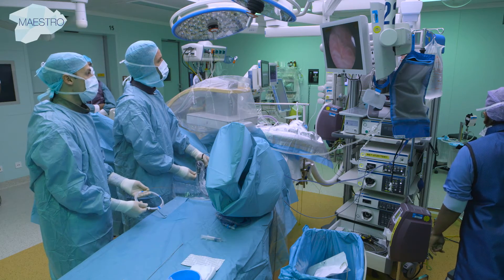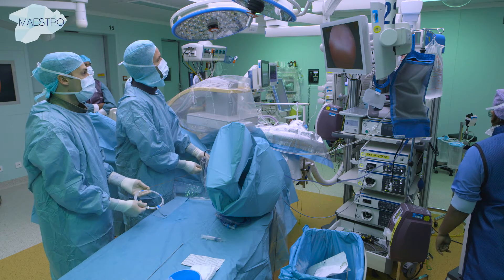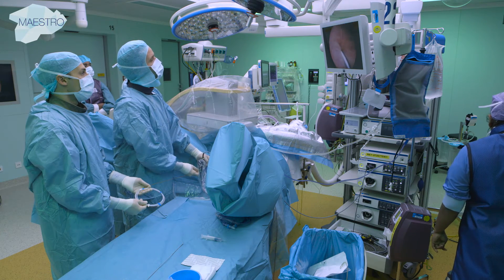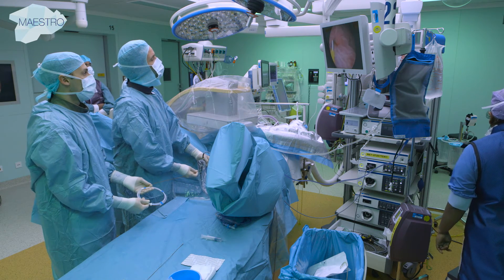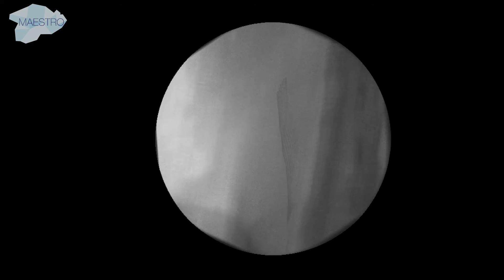Guide wires are most commonly 150 cm long with a diameter of 0.035 or 0.038 inches. When inserting the wire through the cystoscope into the ureter, sufficient radiopacity is necessary for precise placement of the guide wire.